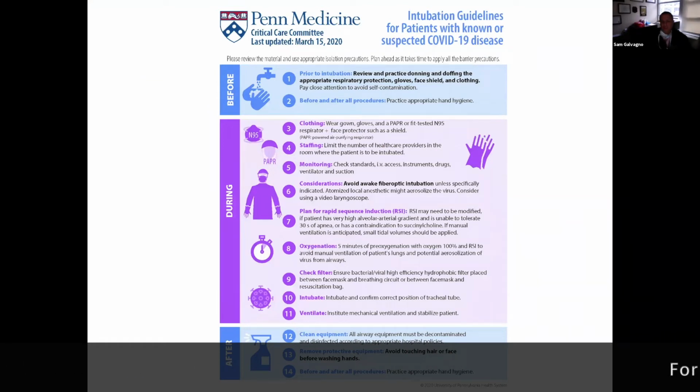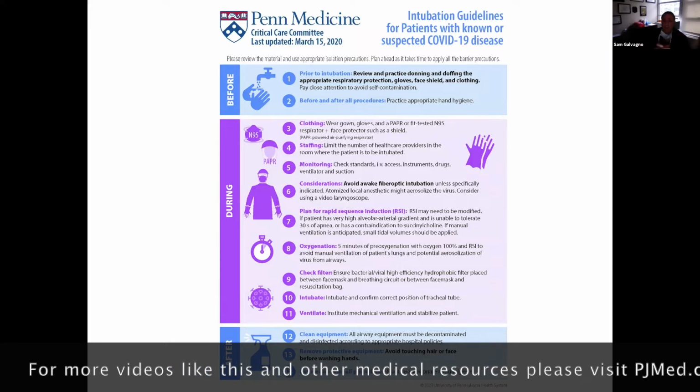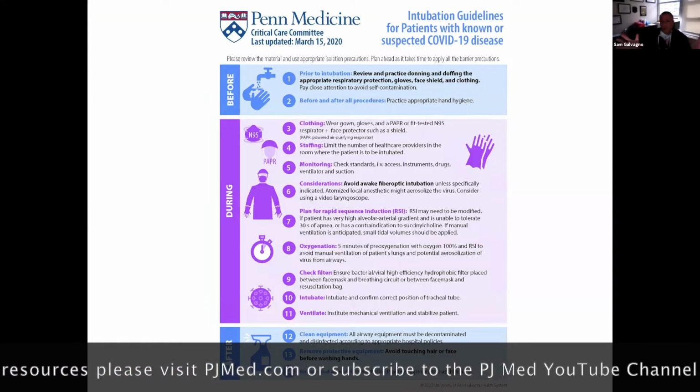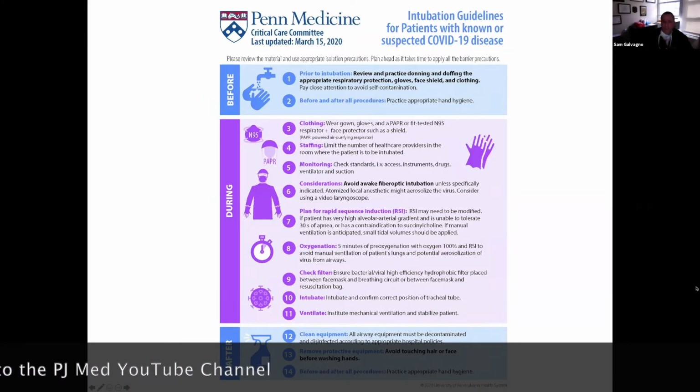If you're going to intubate, and I have intubated a fair number of these patients. In fact, anyone who comes to the door at Shock Trauma, I don't care if they just broke their arm outside the hospital, we're treating them all like they have COVID because this stuff seems to be so contagious at this point. So here's a couple things.